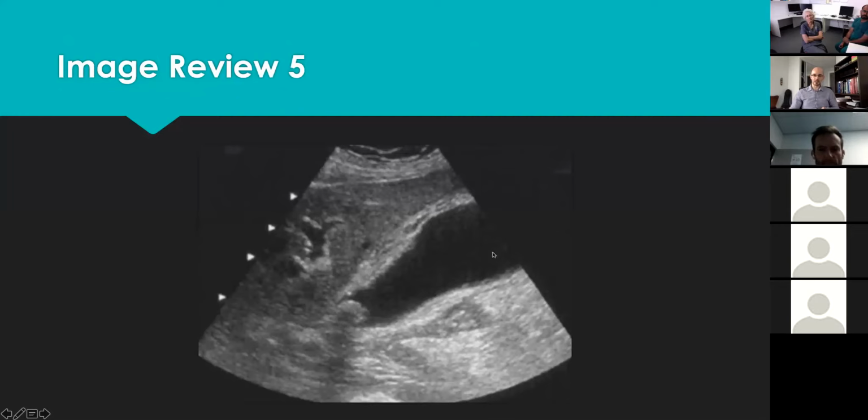So this is a case of cholecystitis due to the stuck gallstone in the gallbladder neck. Pretty much fulfilling the whole picture, other than the sonographic Murphy sign that we cannot see in the image. The rest of it is there. There is gallbladder wall thickening, a little bit of pericholecystic fluid, and the stone stuck in the gallbladder neck.